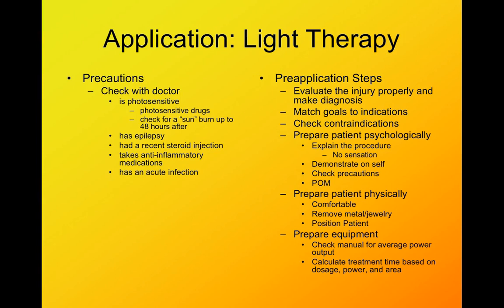And then if they have really a nasty acute infection, though we do know that the light therapy can have some effect on decreasing bacteria in the area, so it could have some benefits, but we'd want to check with the doctor.